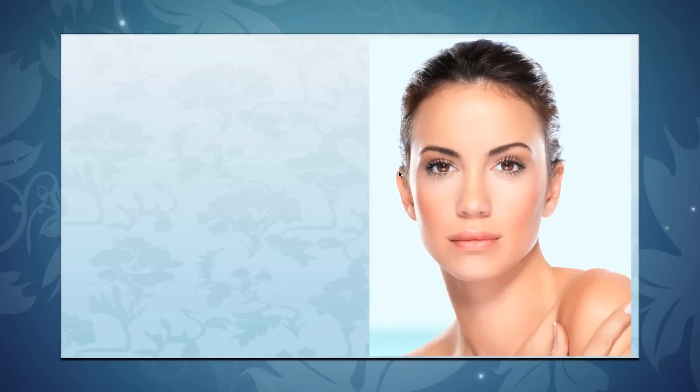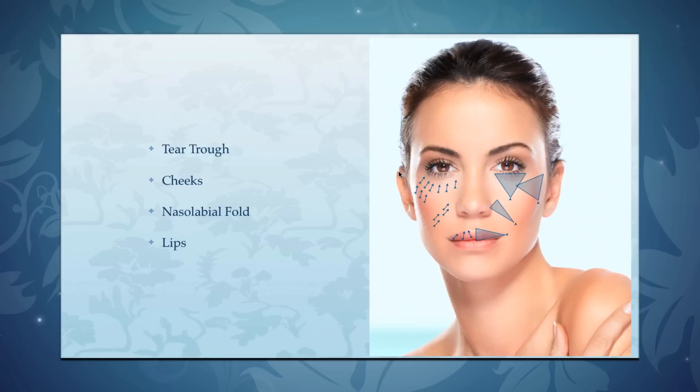Pretty cool, right? And this technique can be used for many areas of the face. It can be used for the tear trough, it can be used for the cheeks, it's a great technique for the nasolabial folds, and it's really excellent for the lips and the oral commissure area as well.